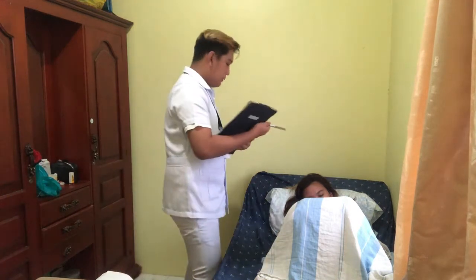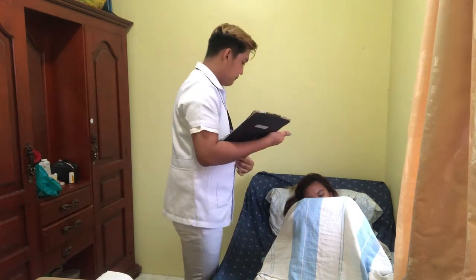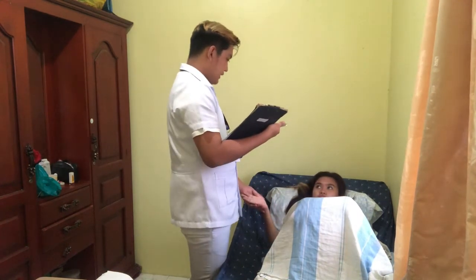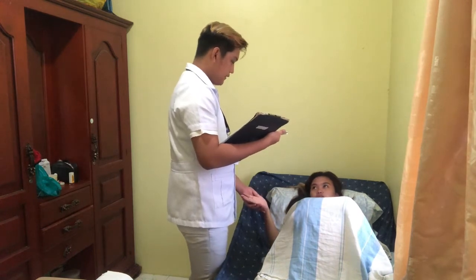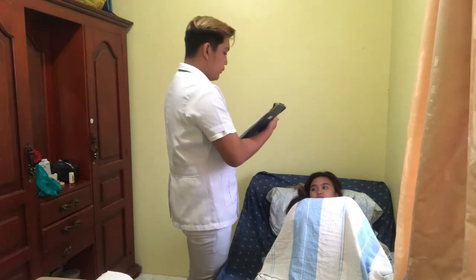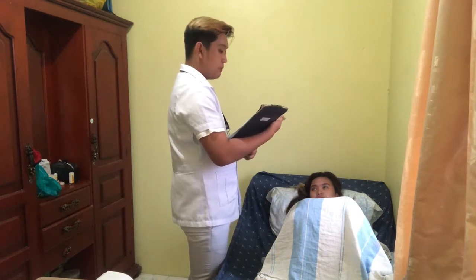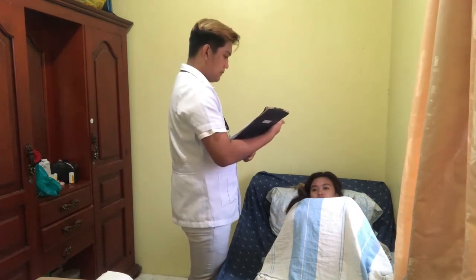Then, after that, we'll identify our patient and explain to them the procedure to alleviate anxiety and promote the patient's cooperation. Okay, hello ma'am. My name is Charles Celesta, your student nurse for today. May I know your name and birth date, please? Okay, thank you. So today ma'am, I will be inserting a urinary catheter, and we will be inserting it in your urethral orifice so that you'll be able to excrete your urine.